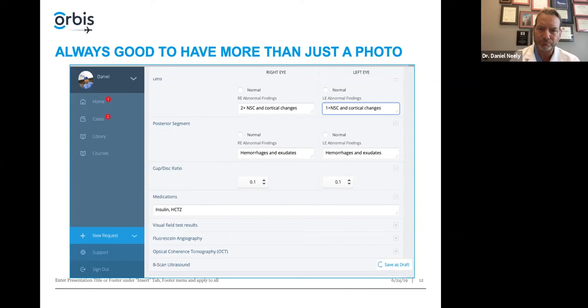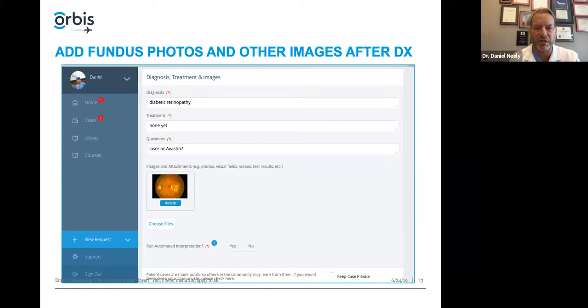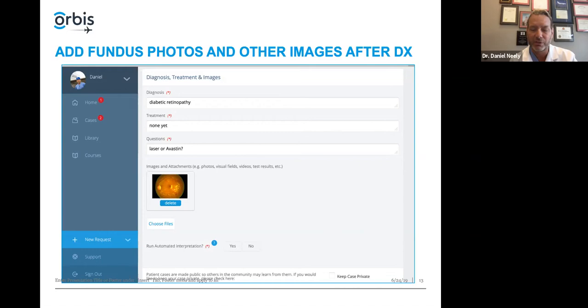Following the history and examination, we move on to entering the diagnosis, treatment, and any specific questions about this patient or treatment plan. You can see we have attached a fundus image for this particular diabetic patient. This is also where you attach other images — a fluorescein angiogram, OCT, visual field, strabismus photographs, external photographs for plastics. You can even attach videos. This section for images and attachments can be any kind of file attachment, including a PDF of your chart.